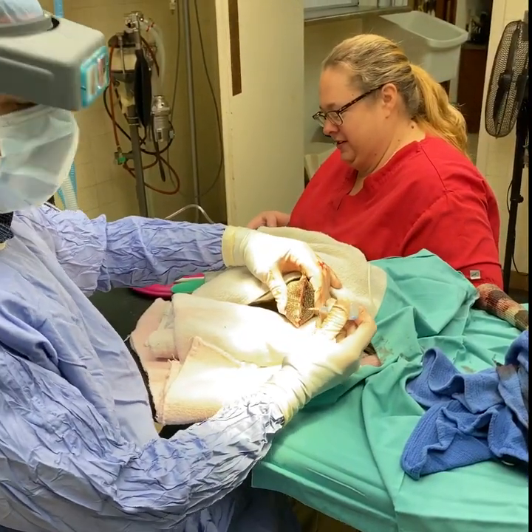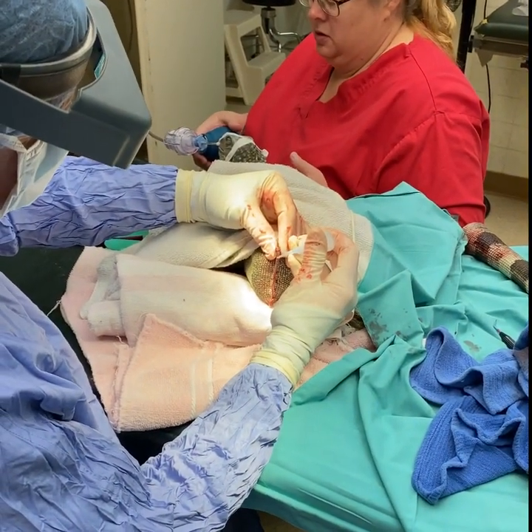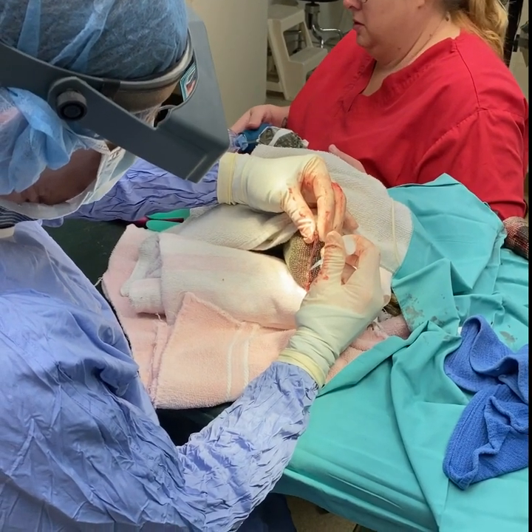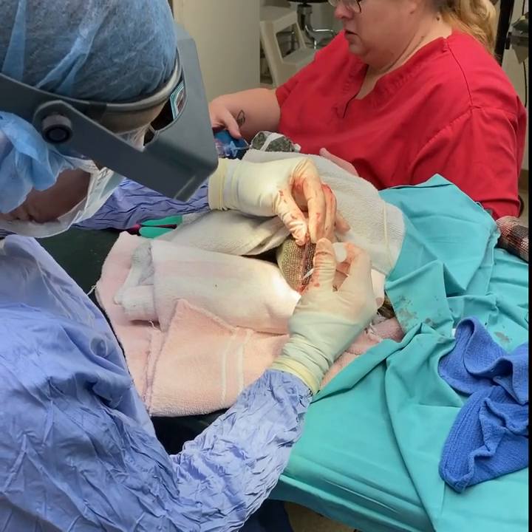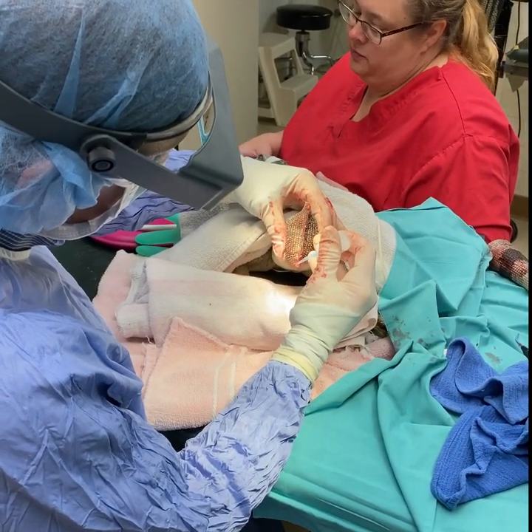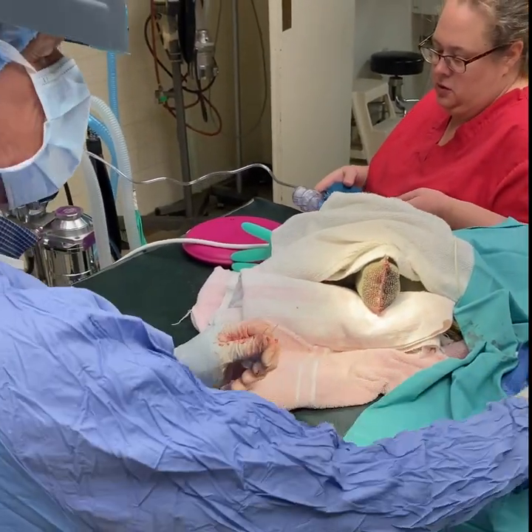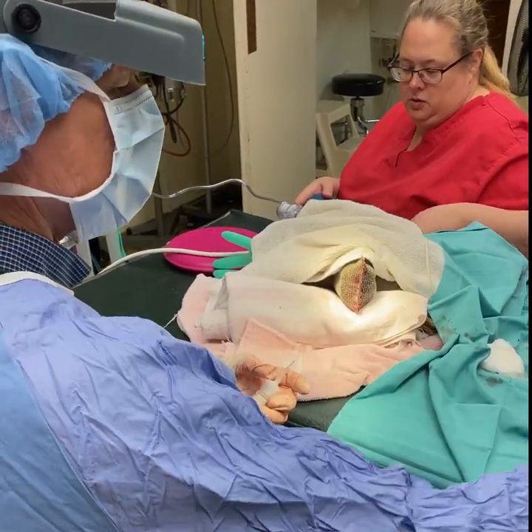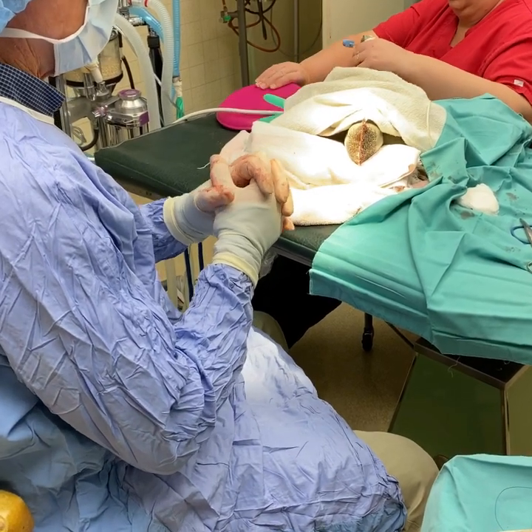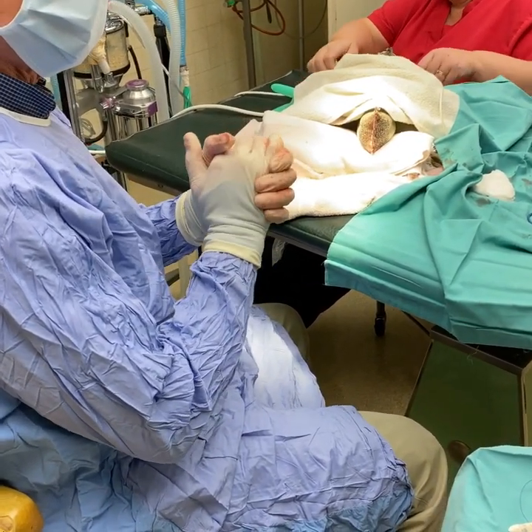We're going to put a little bit of surgical glue over the edges of the incision just to seal it — not really closing but seals it to keep it clean. And there you have it; hopefully that will cure this problem. It had been addressed surgically twice before elsewhere and was progressively becoming more infected.